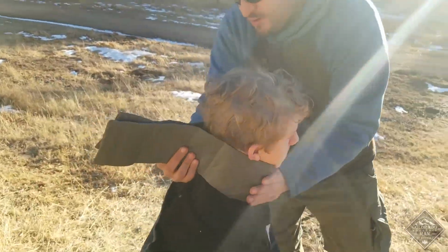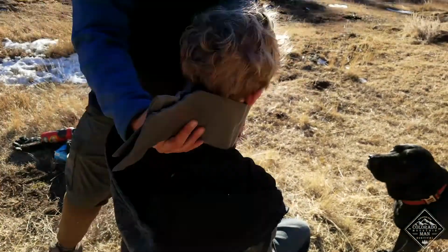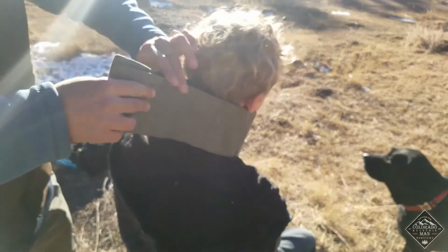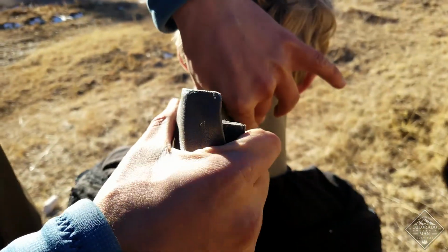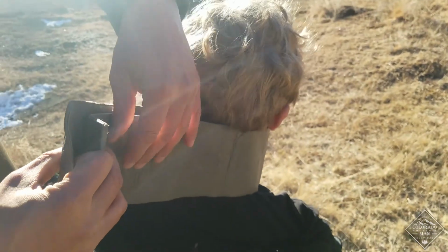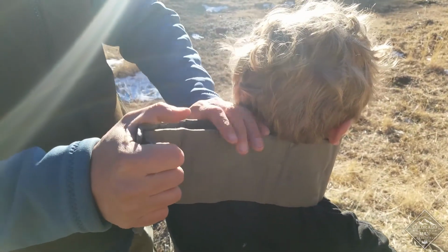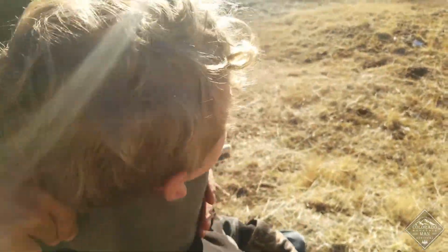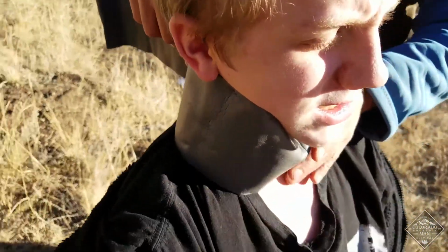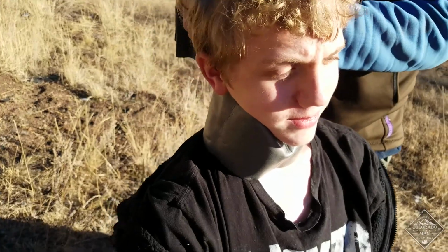Then we come to the back here. So there's a couple options back here. You can grab it like this, and you can roll it in, and that will tighten it, and you'll have it in the back there. That's probably the method that I use the most. So we're doing the Darth Vader choke, so it's nice and around his throat there. You don't choke him to death, obviously. I'm going to pinch right back here.